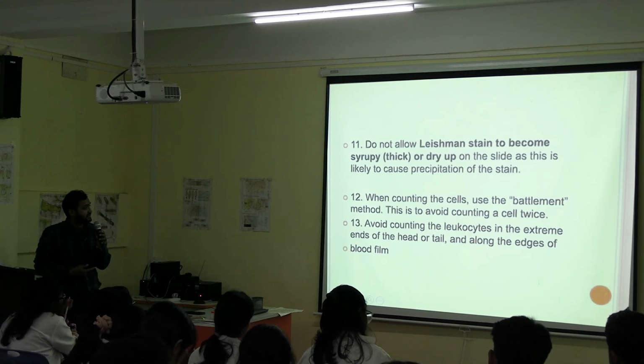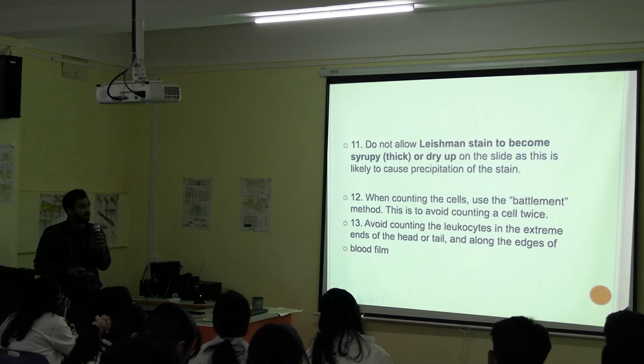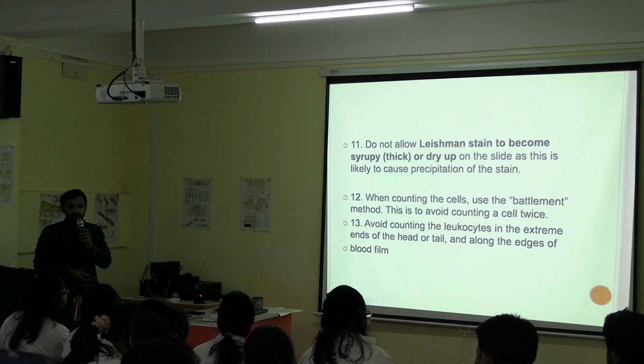So why are we saying to avoid counting the cells in the extreme parts of the head, tail or the edges?